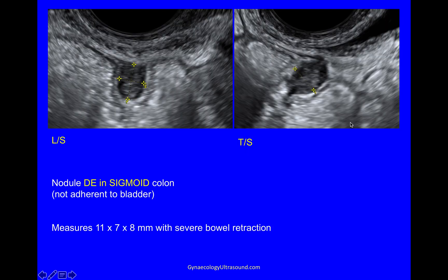Here are some stills of it. You can see a hypoechoic nodule, and this white layer overlying it is the submucosa of the bowel. So this is the anterior bowel wall, high up on the left — so it's sigmoid. You can see that this is a nodule of deep endometriosis, and it's not adherent to the bladder. Measure it in two planes.